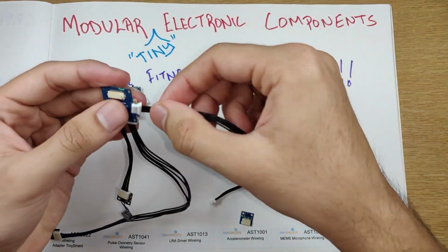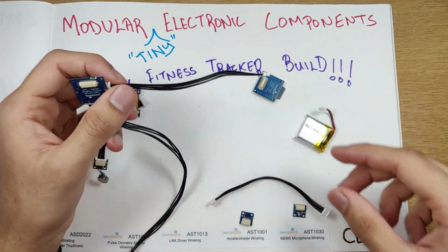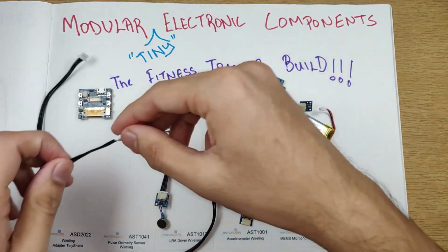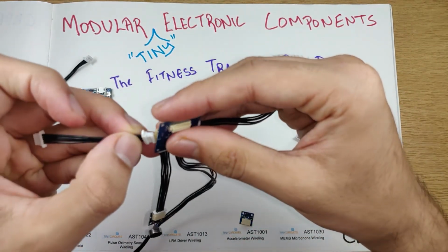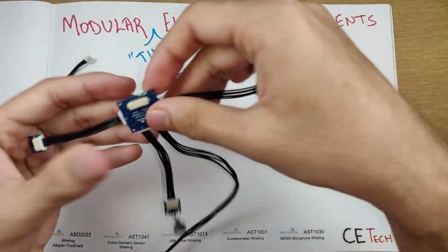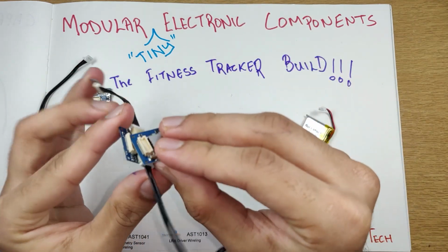I'll connect another wire over here, and to port 0 I'll be connecting the microphone like this, and we'll connect the accelerometer close to the display, so there it goes in port number 4. So that's it about the connection. That was a pretty quick and snug connection.